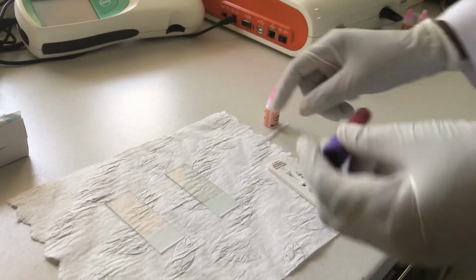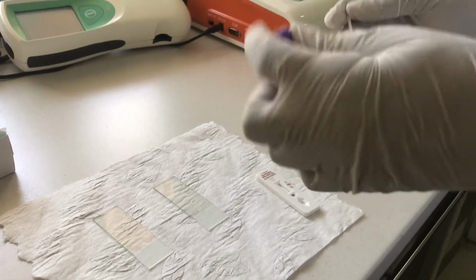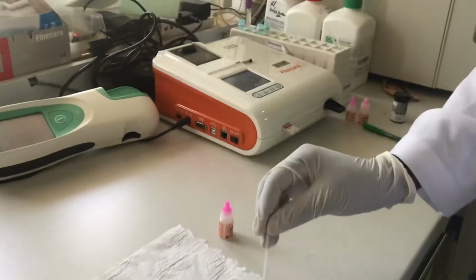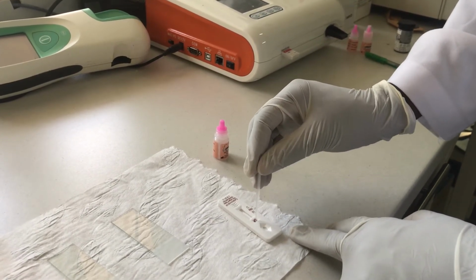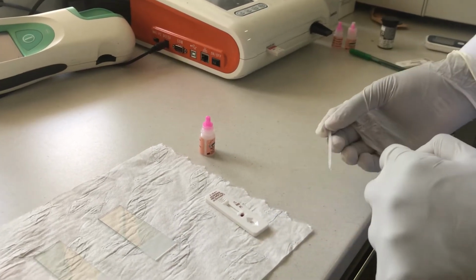And then you should have a sample dispenser. You mix your sample properly. You pick about 5 microliters of blood from the sample dispenser, and you have 2 windows here, 2 dispensing points. The last one is always for our buffer.